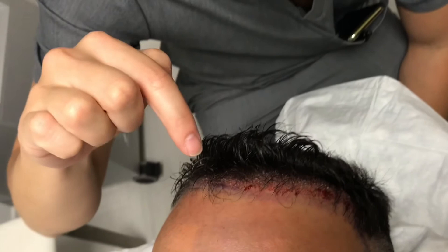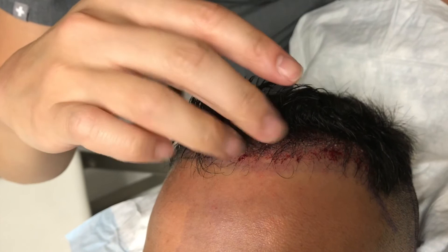We're pretty much finishing up his entire hairline here. You can see the little hairs already placed into each little slot. The hairline is made to fade and be slightly inconsistent, which is more natural rather than just a straight line across the head. All the hairs are growing in the right direction.